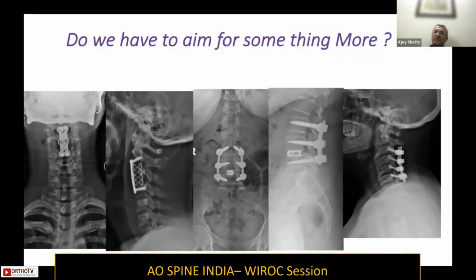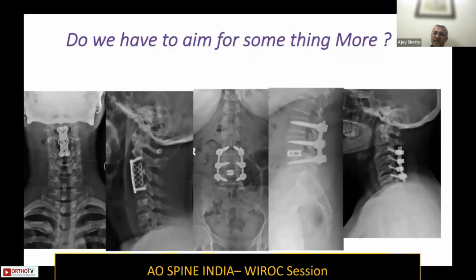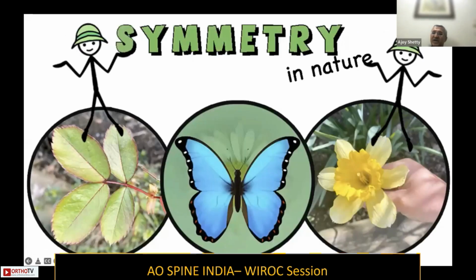If you look at this radiograph, when compared to the radiograph earlier, this one definitely looks good because it is centered exactly in the midline. The screws are perpendicular to the end plate. The screws are symmetric and parallel to each other. Therefore, it looks aesthetically very good.